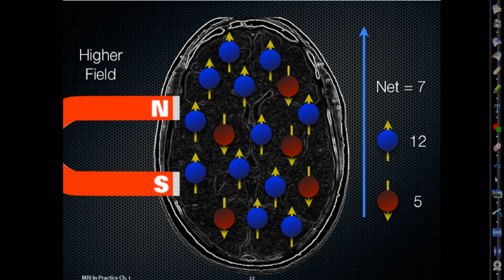So we'll discuss it with a diagram a little bit later on in this lecture, but that's what that's representing. All these low energy spins, since there's an abundance of them compared to high energy spins, because remember, it's harder to oppose B sub 0, so there's not going to be as many. And through cancellation, we create what we call the net magnetic vector, which is so important in MRI because that's really all of our signal that we're getting from our patient.